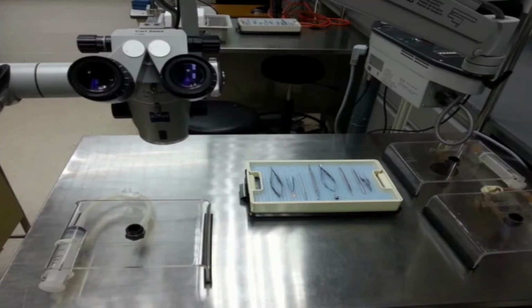Initially, I believe you have all heard before, sometimes you use animal eyes, the goat's eyes or whatever, to mimic the human eye so that you have the experience of how to operate. So you need to know what instruments to use on the goat's eye. Don't just buy a goat's eye and cut it, because at the end you have no benefit from it.